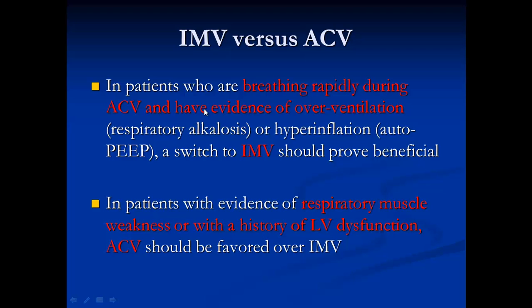But if the patient continues failing SIMV, the best mode for this type of population is assist control.